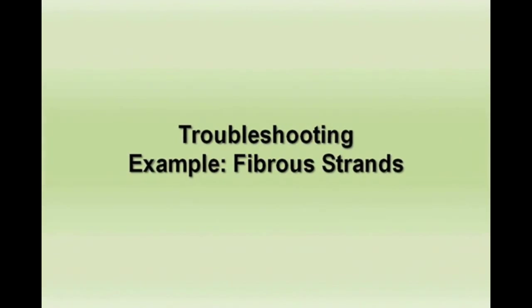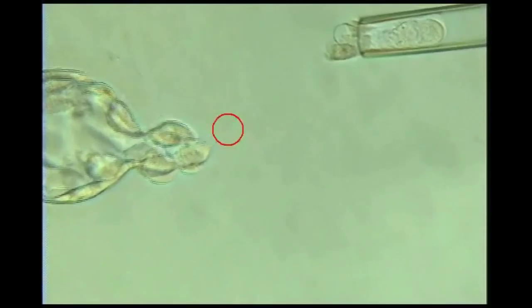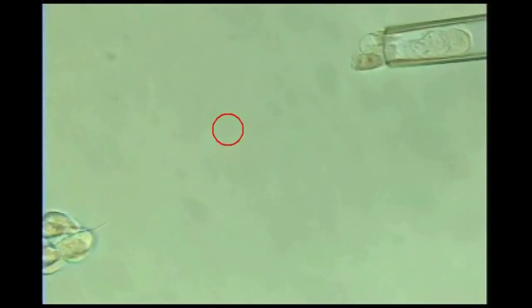A troubleshooting example of fibrous strands. Note the strand connecting the biopsy sample to the embryo. No laser pulses are administered — rather, manual pulling releases the sample.